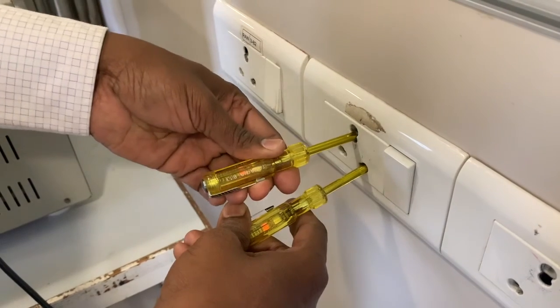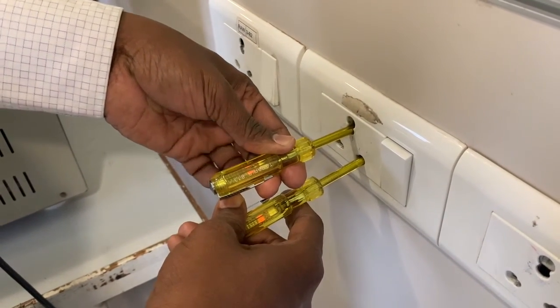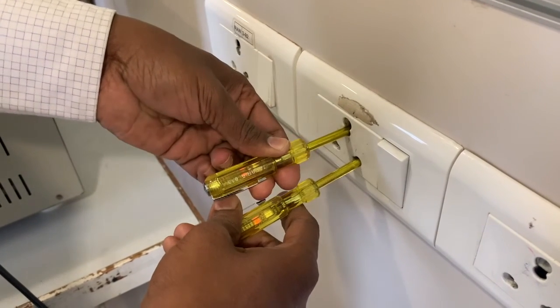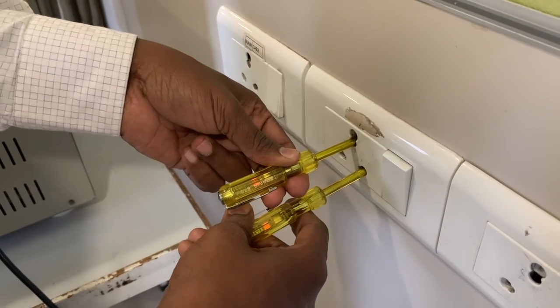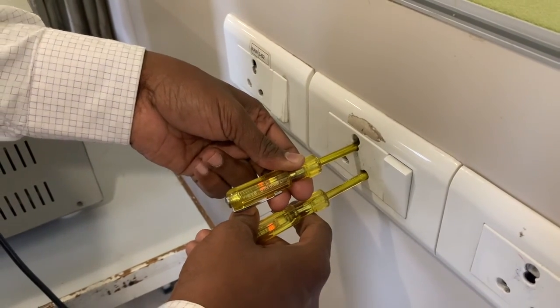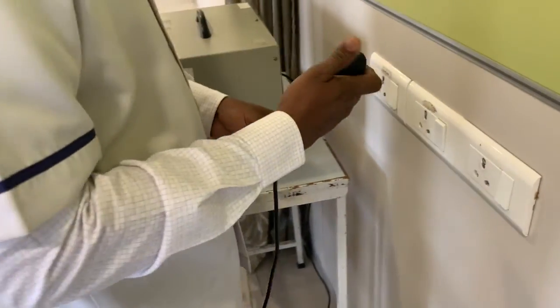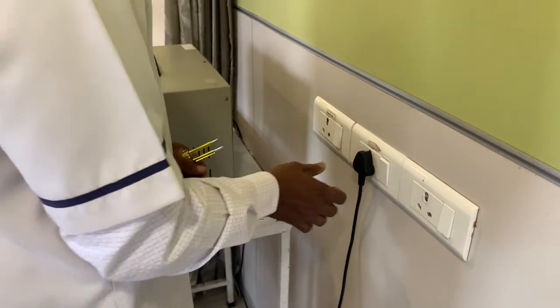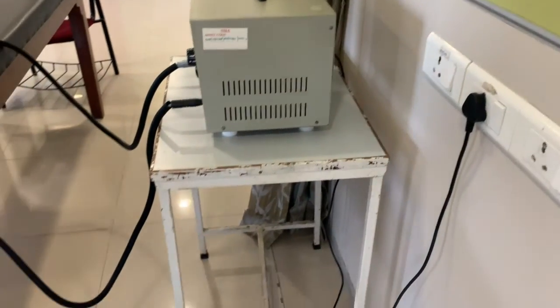Next, I'm testing the earthing. When I connect it to the earth also, there is glow, and the glow is same as when I connect it to the neutral. That means the earthing connection is also proper. Next, connecting the power cable. Once connected, I've switched it on.